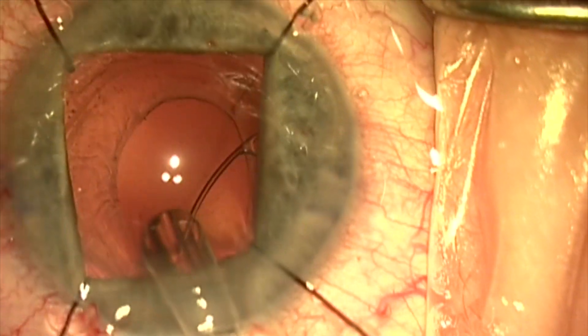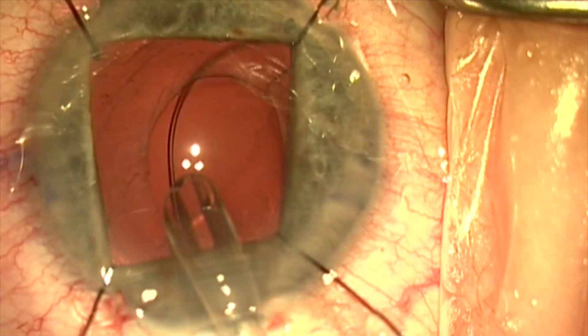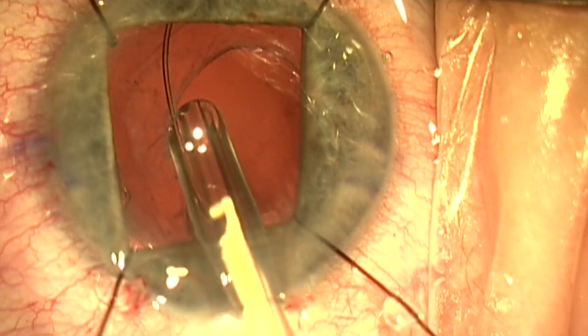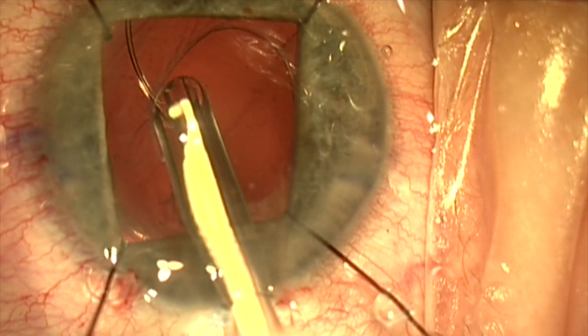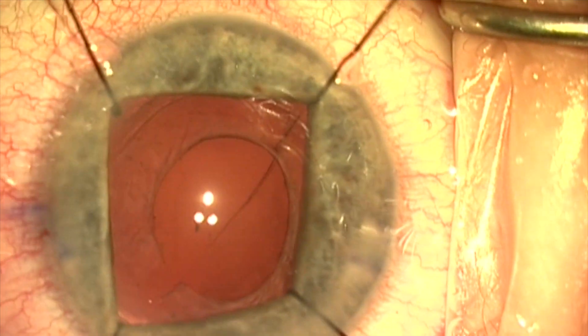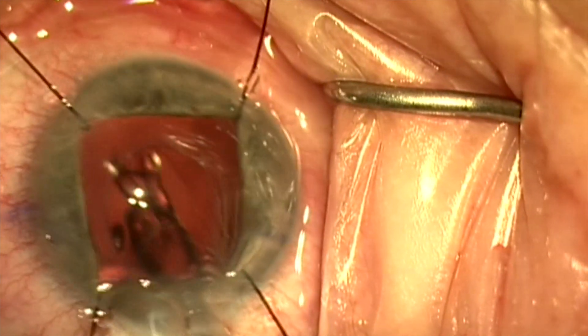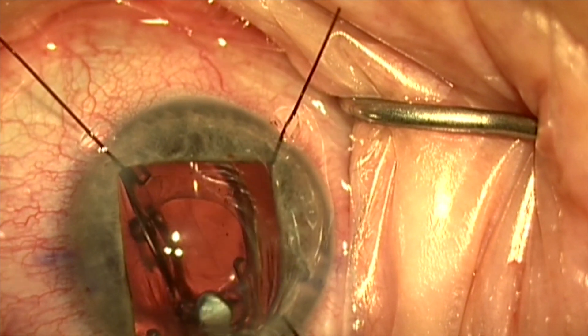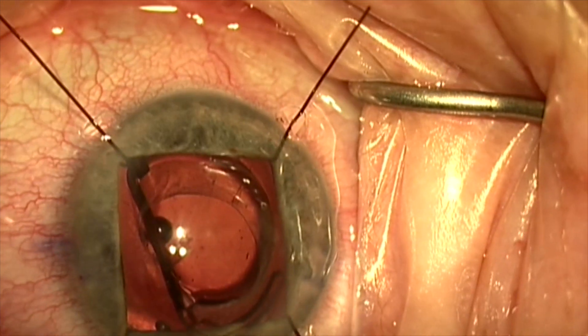The zonules are weak here, so we're going to place a capsule tension ring to provide better structural support to the capsular bag and to equilibrate the zonular support. This will expand the equator of the bag and make sure there's no fibrosis inhibiting putting the new lens on the proper axis.